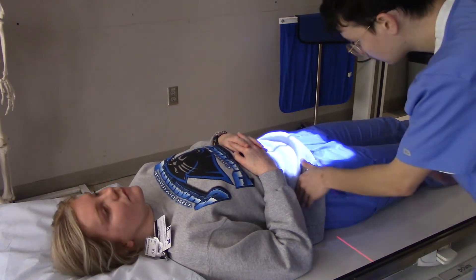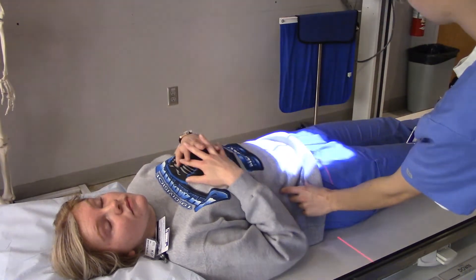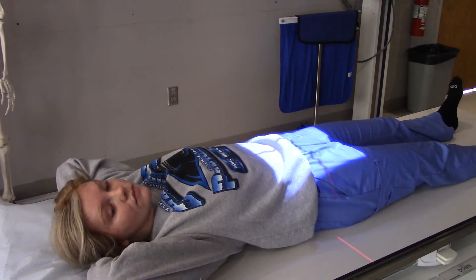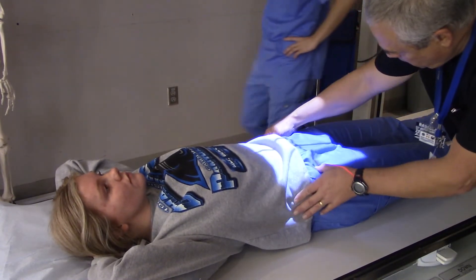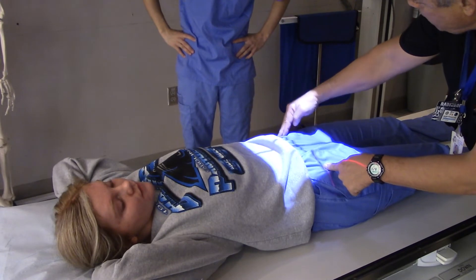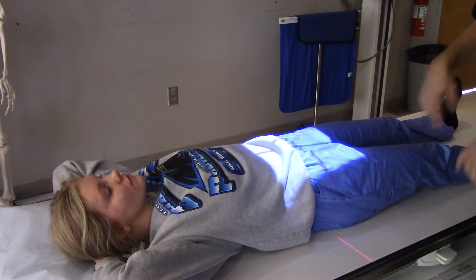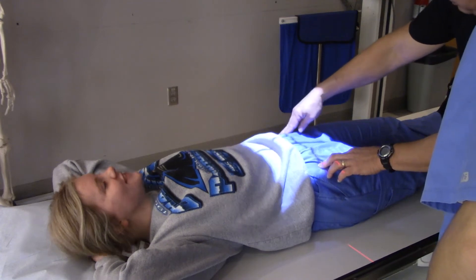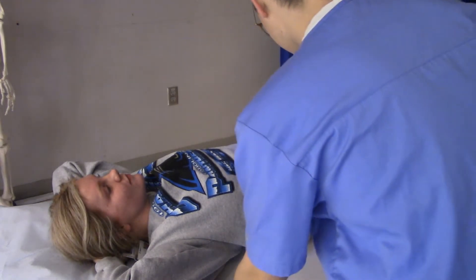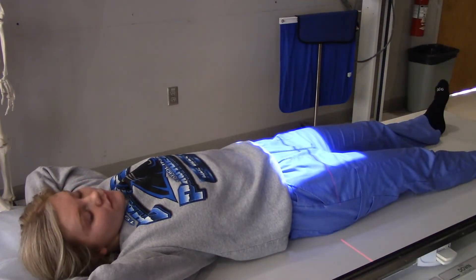The light field should be about an inch and a half above the iliac crest approximately. If you're open to 14 by 17 and you've got your central ray correct — two inches below the ASIS — that's right. Hold still. You're right at the ASIS. So you're actually way too high. The symphysis is going to be just above the inseam of her pants, so let's release and move this patient. That's much improved.